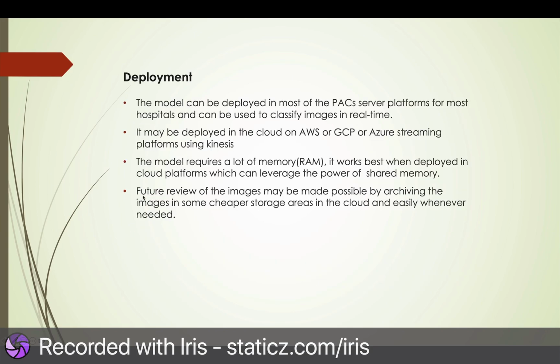So for deployment of this model, I realized it really works well on a cloud-based platform. It works well because these are pooled, distributed memory, which is scalable wherever there is need.